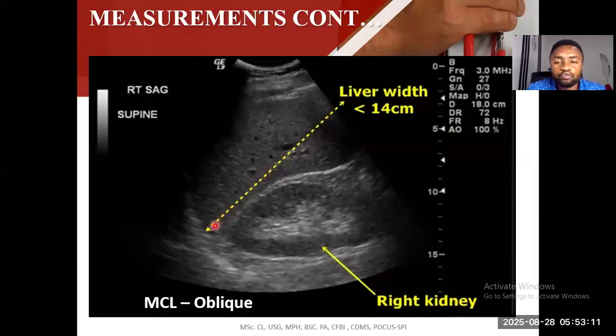All right. So have you seen how to measure the liver? This is the right kidney, isn't it? What is the name of this part of the kidney? We are not at the kidney yet, but what's the name of this part of the kidney? Who can tell me? No one. Really? Oh, the echogenic aspect of the kidney. I see. All right.